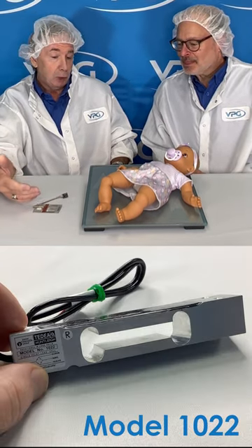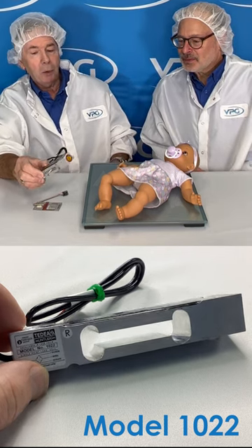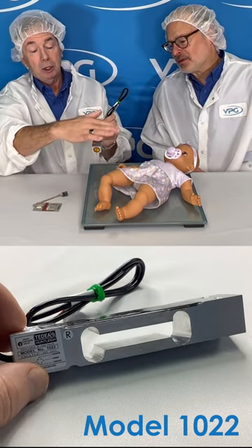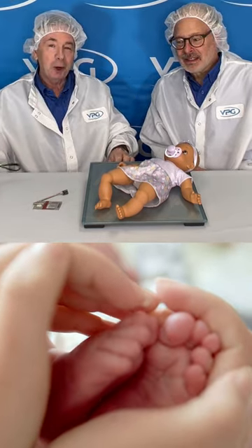As the child grows and moves into a more standard scale, we can certainly offer the 1022, which is a single-point load cell designed to be placed underneath a platform such as a scale. The platform goes on top — infants weighed, persons weighed, child weighed. We're there from start to finish.